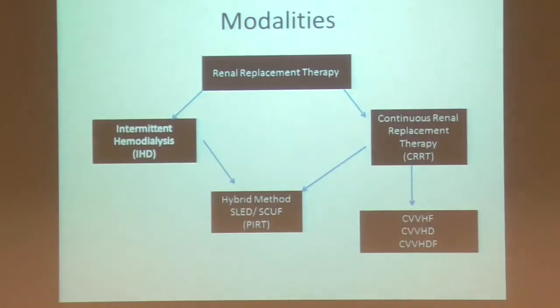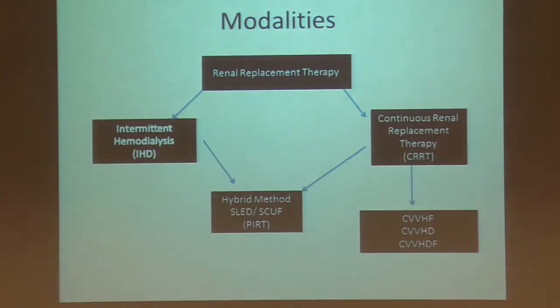Before I jump to the modalities of CRRT, anytime you open any CRRT text or book, this is what you see: acronyms. I thought, let me take a step back and explain a couple of the different types of dialysis we have. Then all these acronyms make sense, and when you see certain studies, you can understand why certain patients do better with certain types of dialysis and where it's really indicated.